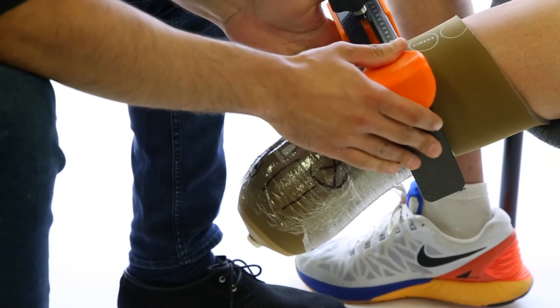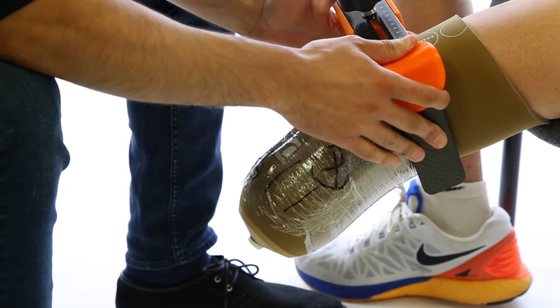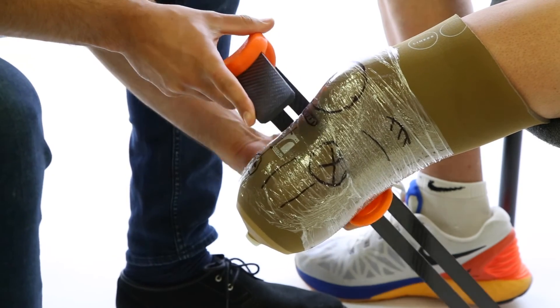We also need the proximal ML dimension compressed, proximal to the femoral condyles, and the AP compression at the mid-patellar tendon.